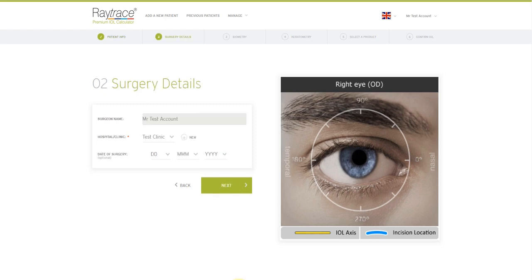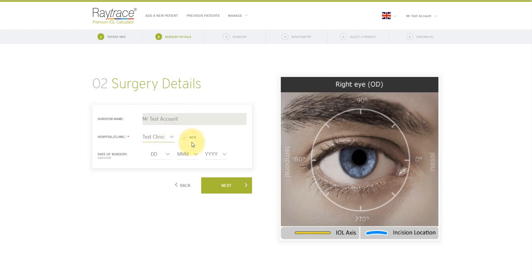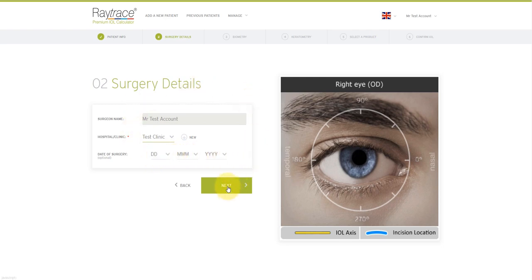Now you need to add surgery details. Surgeon name is pre-populated with your account. Select the hospital or your clinic from the dropdown. If it's not listed, just click new here and you can add details for that. Adding the surgery date is optional. It may help with your surgery planning. And then simply click next.